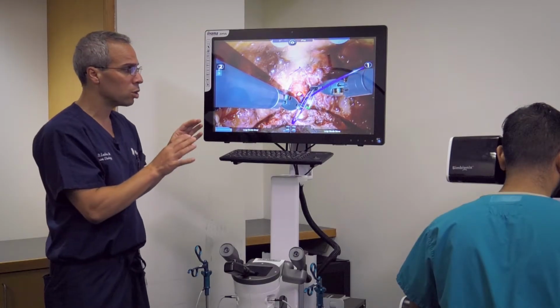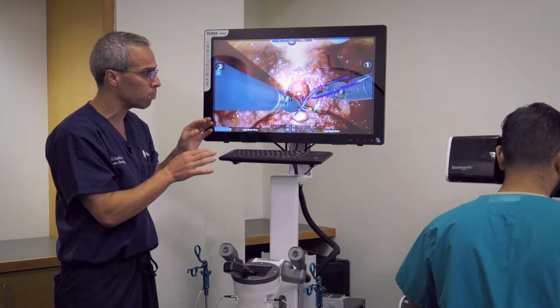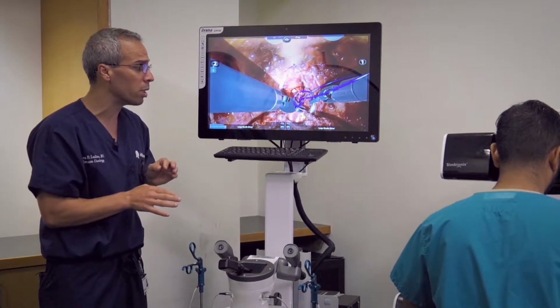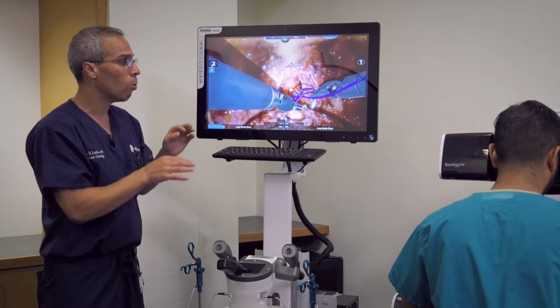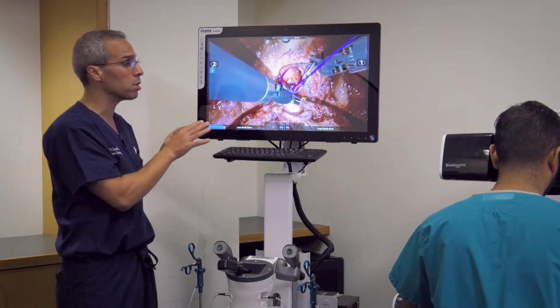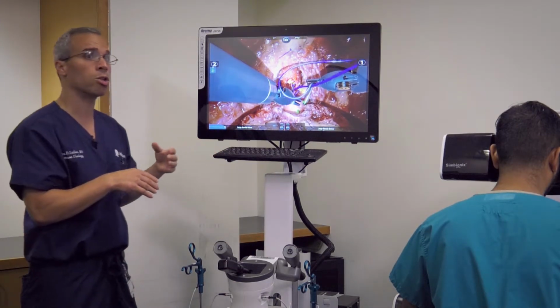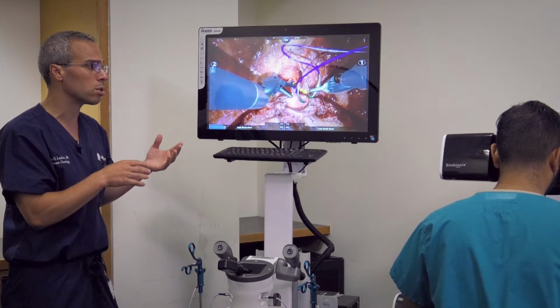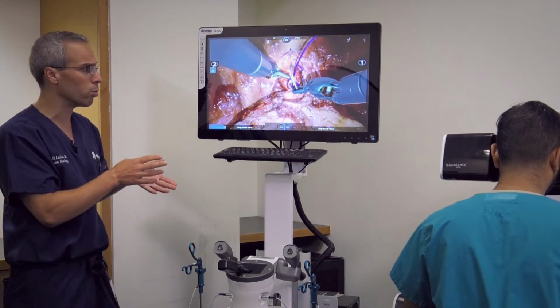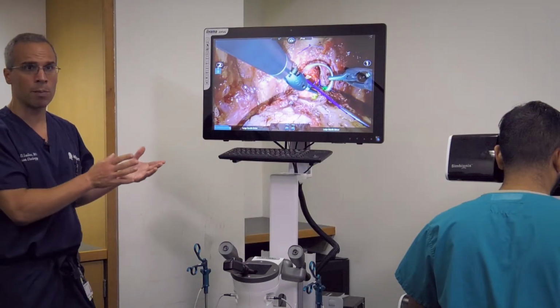This is guided. So he's following the yellow dots, which turn green when he's put the needle where it's supposed to go. And if he doesn't put the needle where it's supposed to go, it actually turns red. Once Amar becomes familiar with this portion of the simulation, he can go a step further and go to the freehand anastomosis, where he does it, but he's not being prompted on where to throw the needle. And this is how we do it in the operating room.